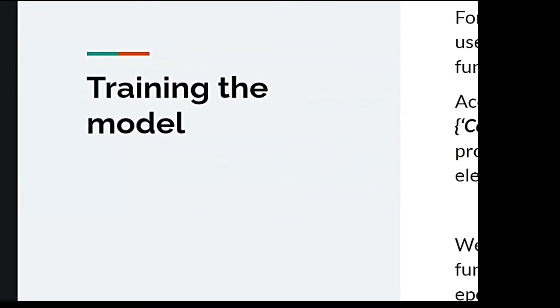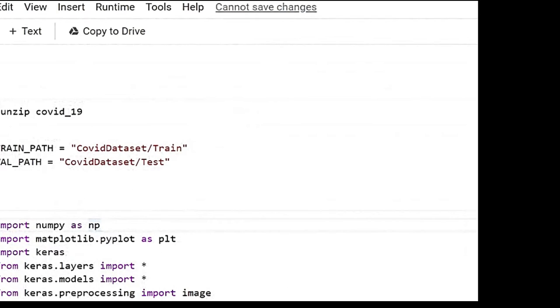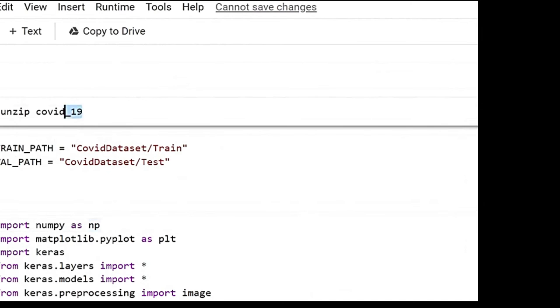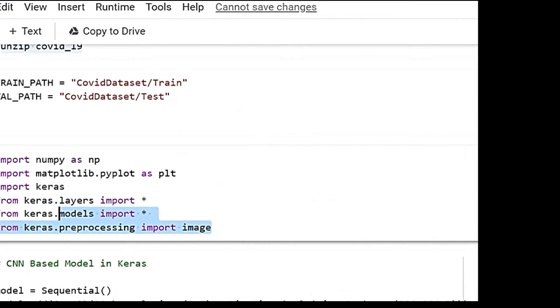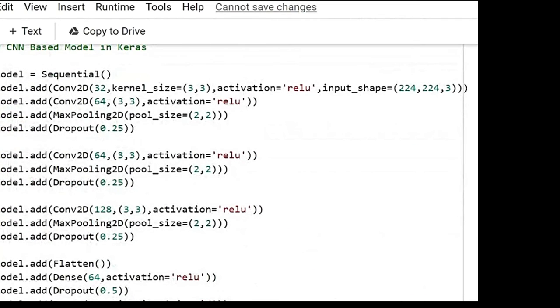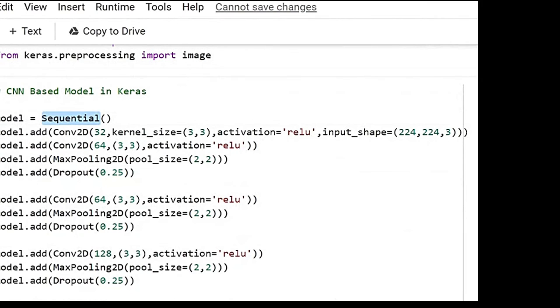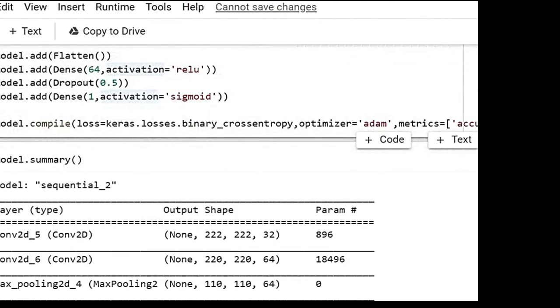And while training the model, I have used data generator function. And I have indexed the COVID-positive images as COVID-0 and the normal images as 1. So this will be really very clear if I show you the actual Google Colab Notebook, which is here. After uploading the data into our Google Drive, I have generally unzipped all the folder. The folder name was COVID-19. And I have mentioned here the train path and the validation path. That is the test path. After that, we actually imported all the libraries like Matplotlib, Keras and all the libraries. Keras is basically a high-end API for TensorFlow. TensorFlow has been used here. And here, this is the actual our model, CNN model, the sequential model. And the sequential model has some layers and also the activation was ReLU for each of the steps.